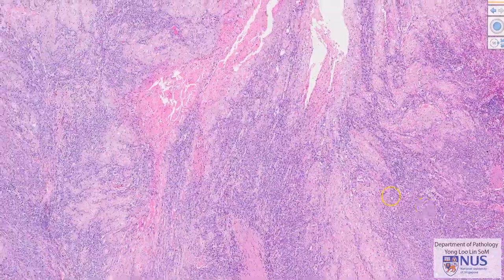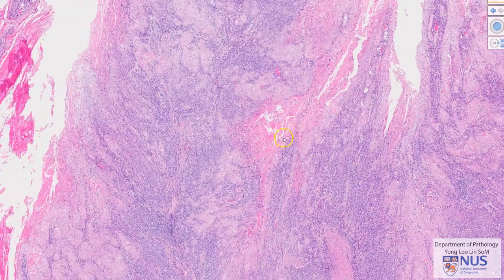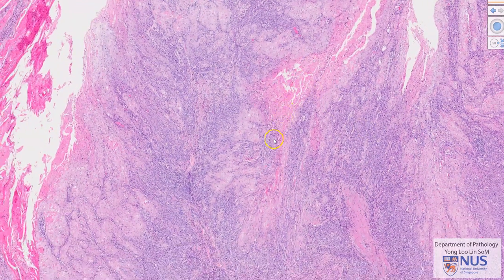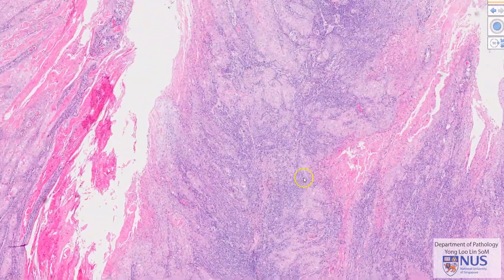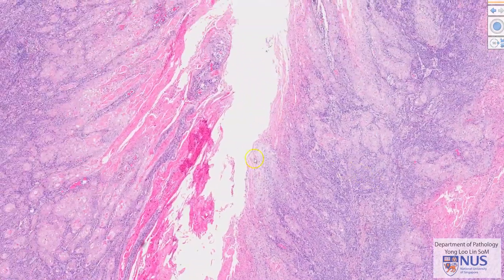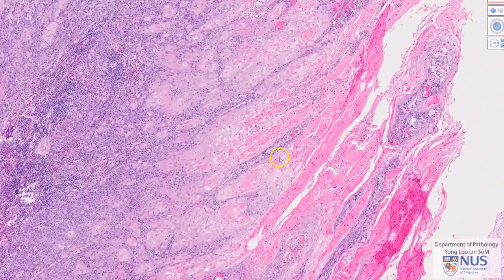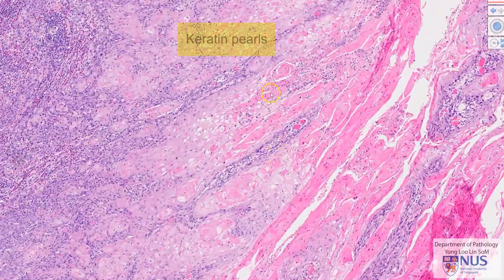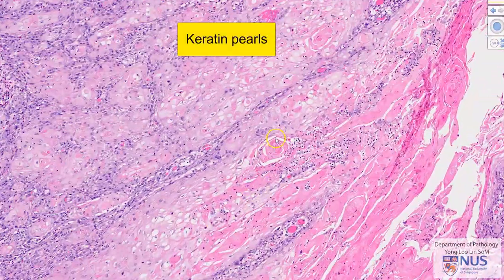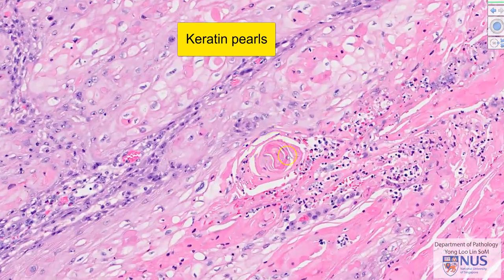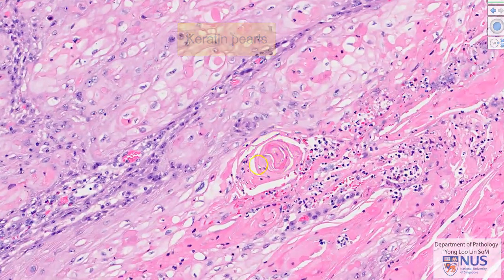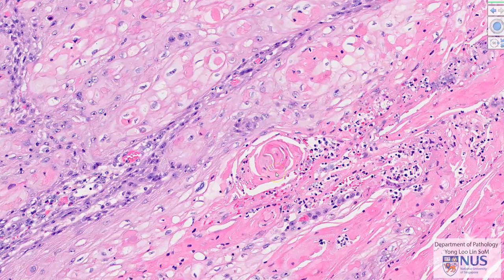In other areas, we can see that there is keratin formation. So this is keratinizing squamous cell carcinoma, and we can also appreciate the presence of a few keratin pearls. Here is a keratin pearl, and this is a classical feature of keratinizing squamous cell carcinoma.